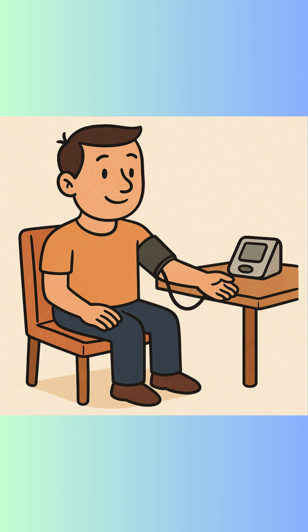Step two: remove clothing from your upper arm — don't just roll up your sleeves — and support your arm at heart level.